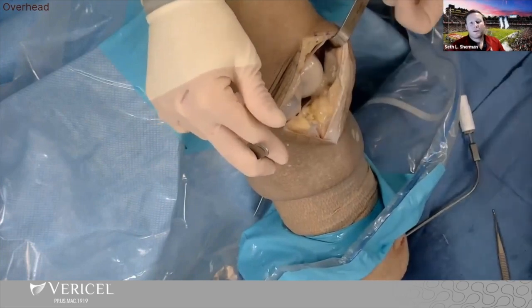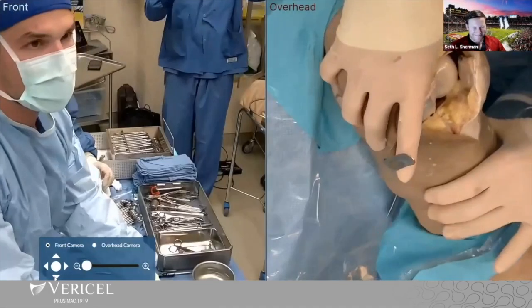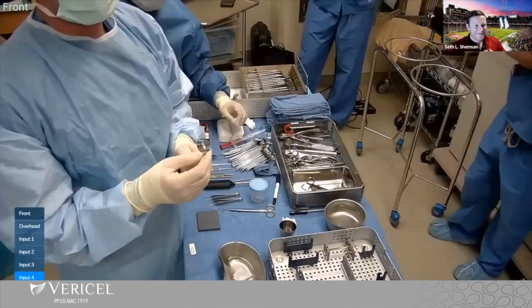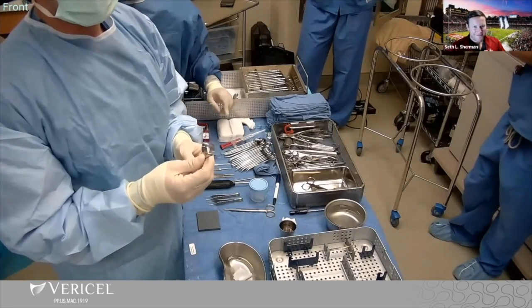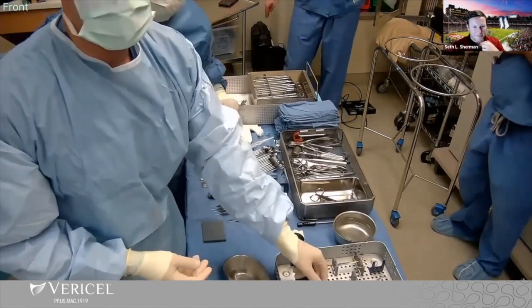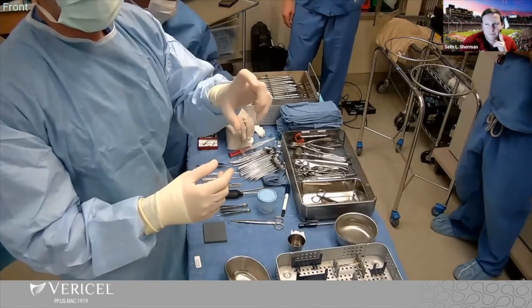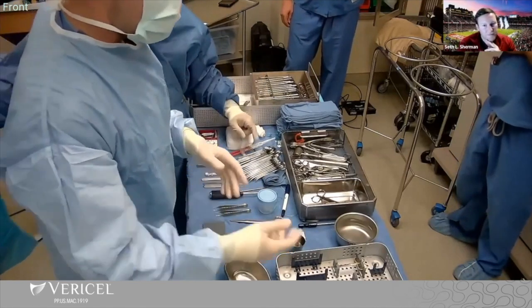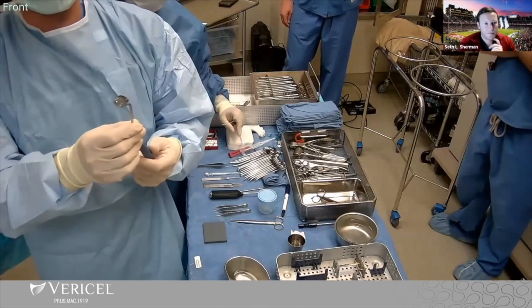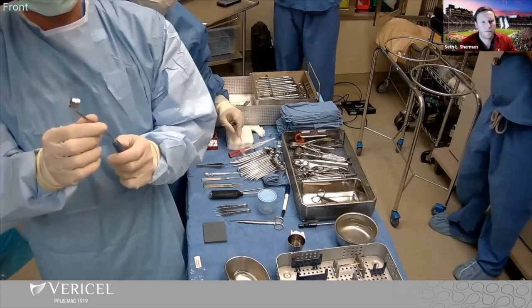We only have a few options here. Before we do this, let's go to the table really quick. We have a trial set — this is for cadaver use, but we normally have a bunch of different options. These really speed up the procedure and make it efficient. Most of my defects will fit within these levels — larger, smaller. When you're doing a real procedure there are like seven or eight different options. I chose in this case an oval, which I do a lot especially on the trochlea or patella — it gets that elongated shape without being too wide.